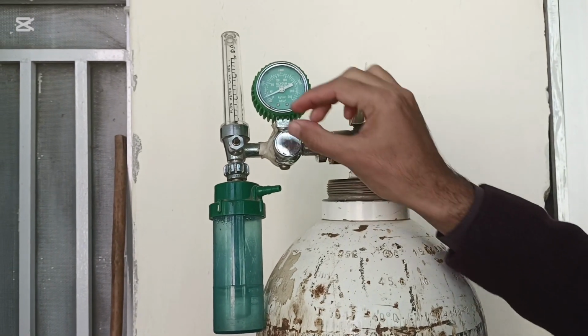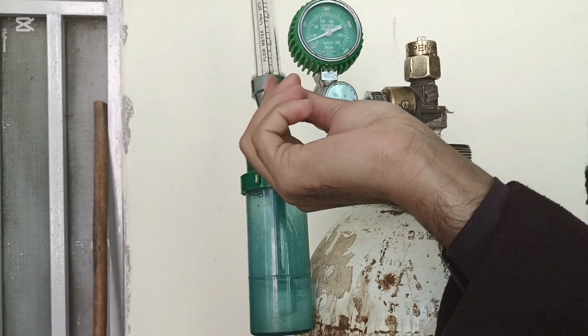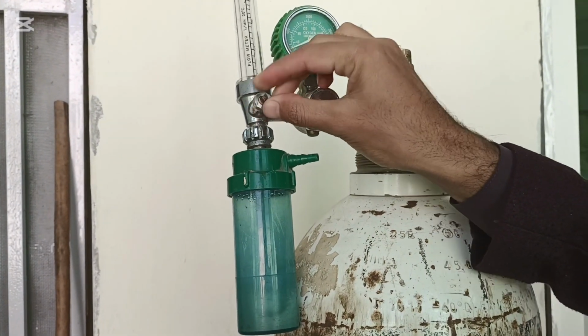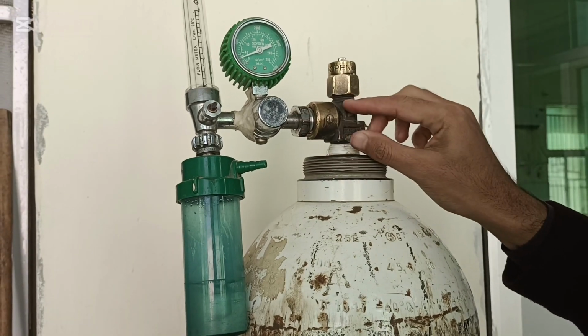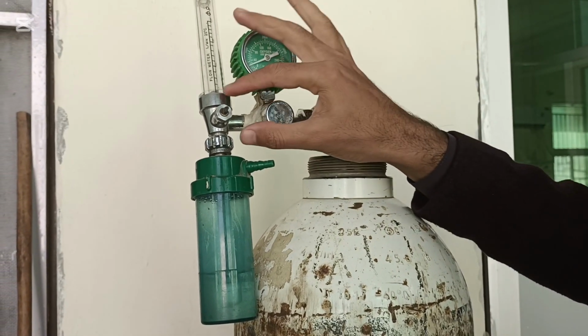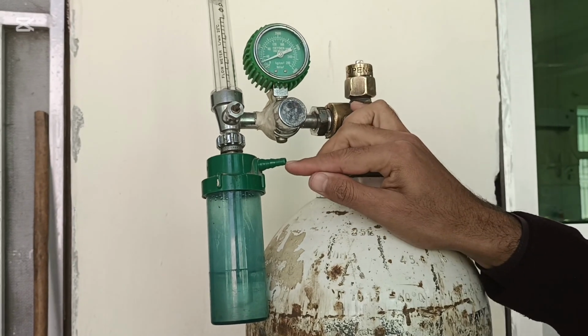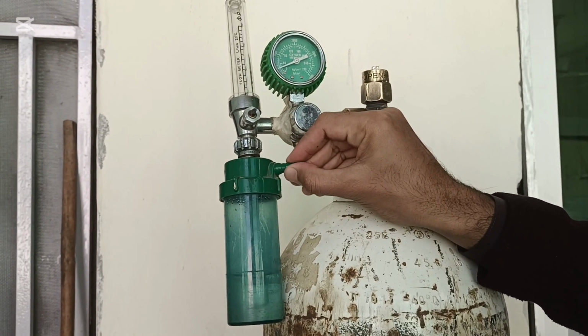As you all know, there is a button you can see over here. This is called a control valve, and this is the inlet through which the oxygen flows from the cylinder into the oxygen regulator, and this is the outlet. You have to insert the face mask tube into this outlet.